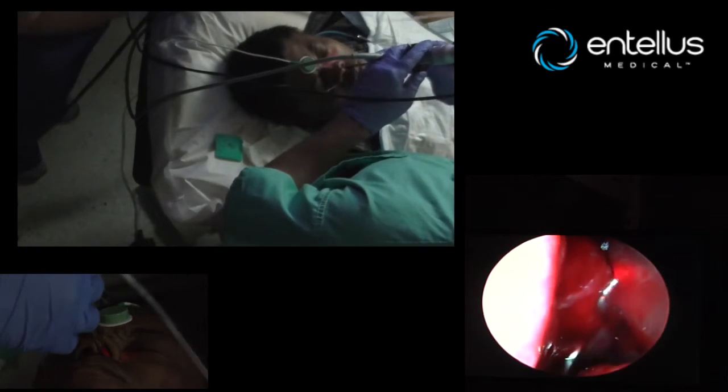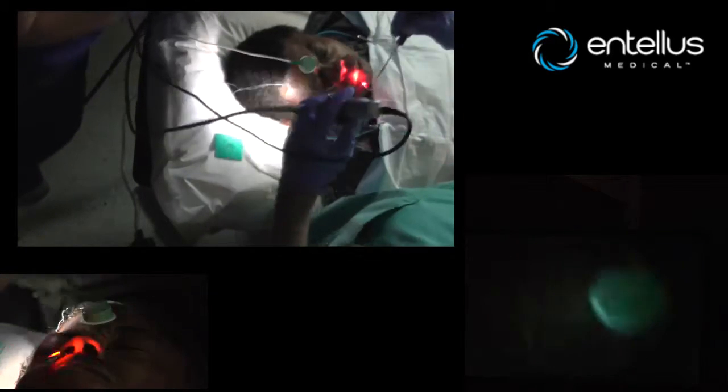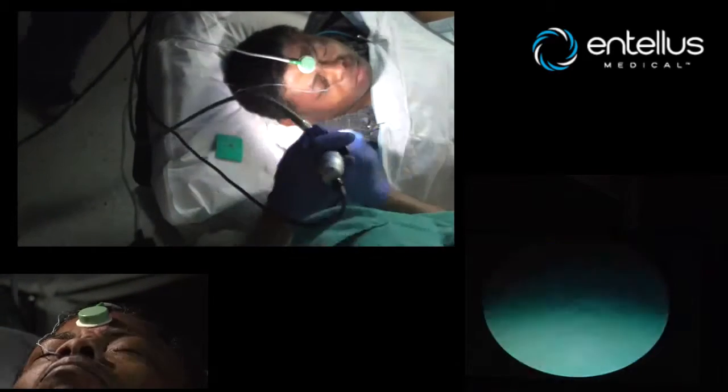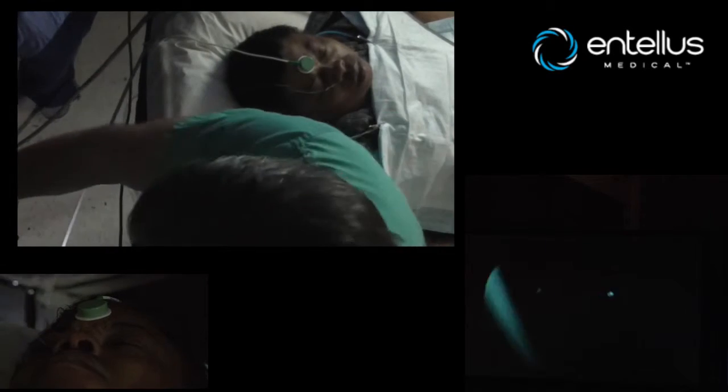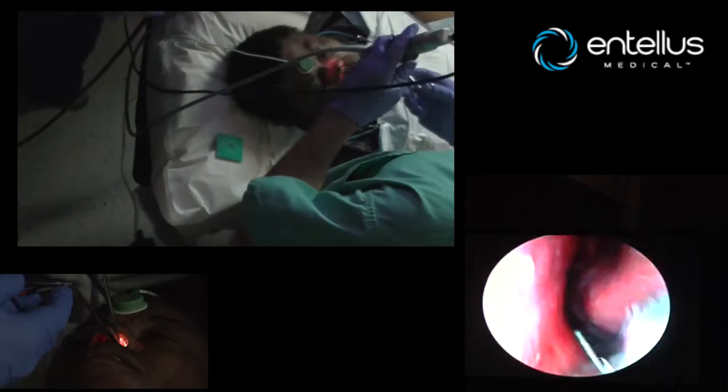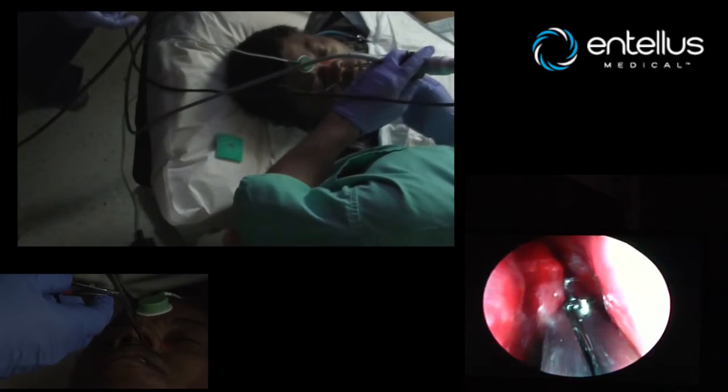One thing I do like about the Entellus system over other systems — and I've used all of them — is that you're able to see where your device is going. Some of the devices are very, very large, and it limits your visualization of actually what you're dilating, which in a tight space can be very, very difficult.